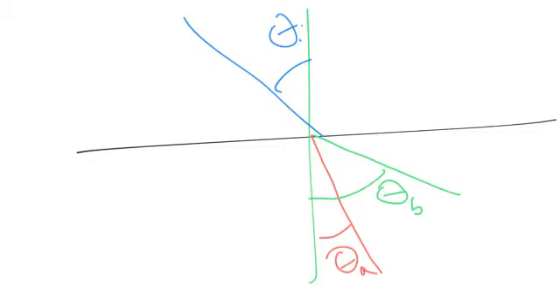But this is a round structure, so if I want to see what's in this wedge-shaped area where there's no signal, I'm going to have to bring my transducer over at an angle, and I'll see that, but I'll lose it somewhere else, won't I? Yeah. So there's nothing you can do. I mean, if it's happening, it's happening.